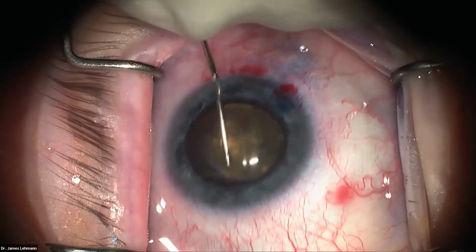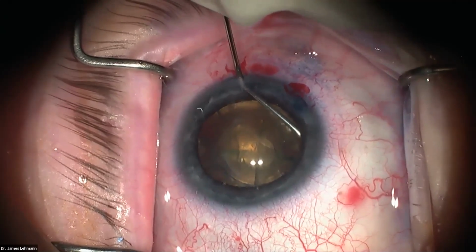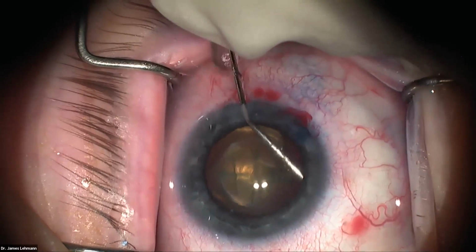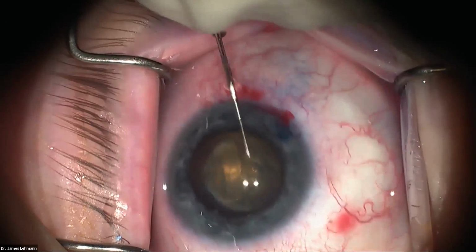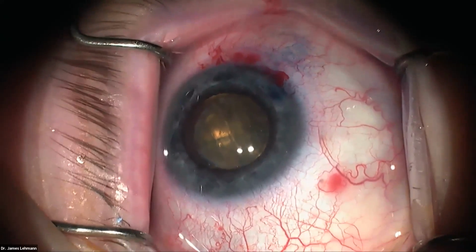It's a fairly dense nucleus. I'm going to put a little more viscoelastic, and we want to be able to confirm that it's mobile. And so I'm going to try to rotate it a little bit. And it looks like it rotates pretty freely there.